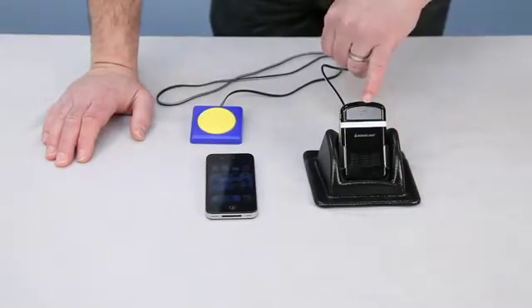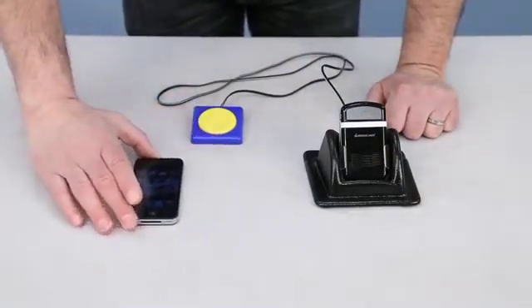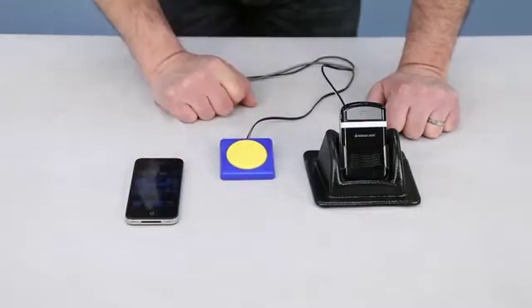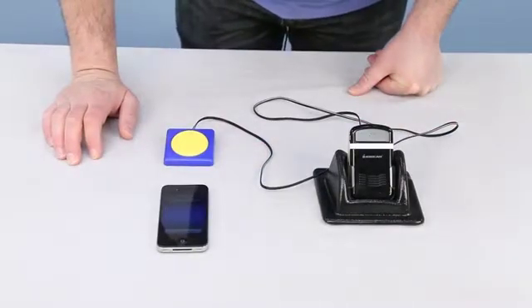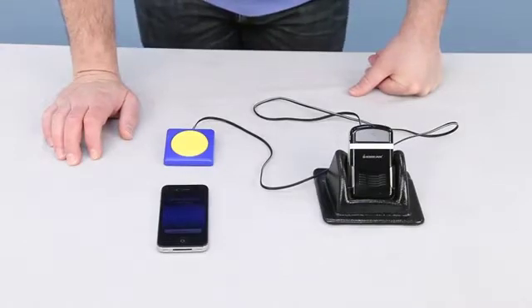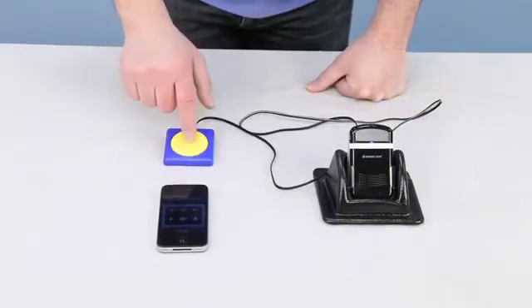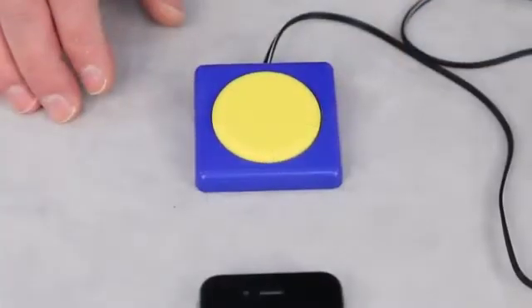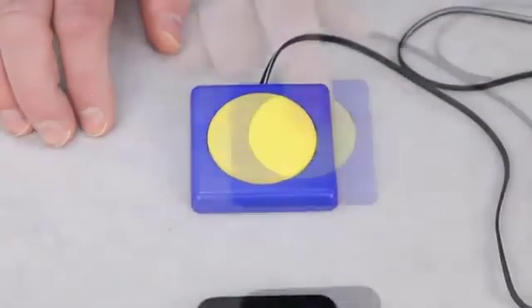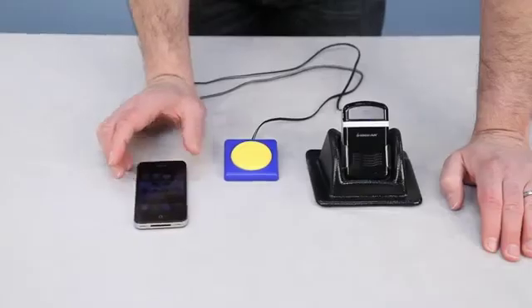The microphone is in here to pick up your voice, and again this is your volume control. I'll show you once again to place a call — it's very simple. Just hit your switch: Siri, call enabling devices. Calling enabling devices. Hello, you've reached enabling devices, toys for special children. To simply end the call when you're finished, just hit your switch again. With just one activation of your switch you're able to wake up any smartphone from its sleep mode and then place a call with anyone in your phone directory.